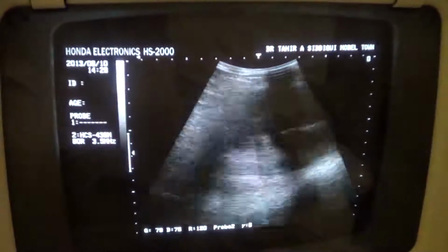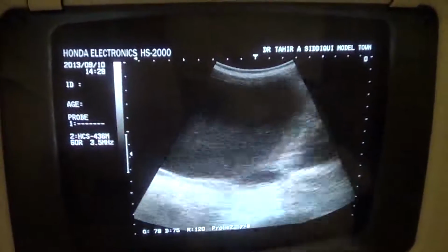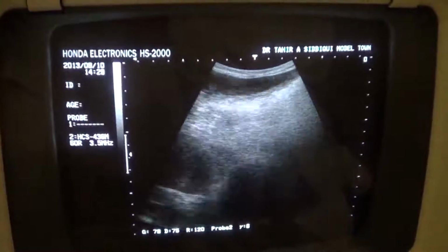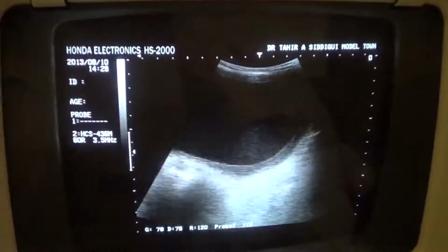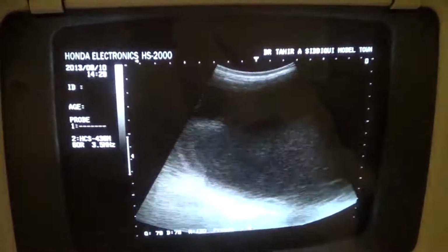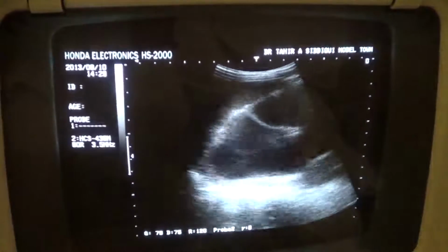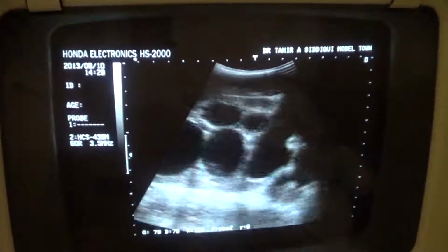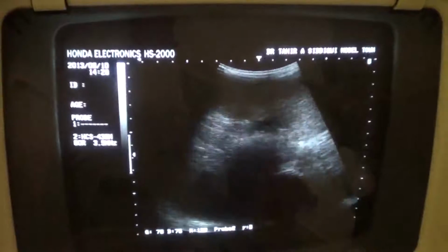So dilated, convoluted ureters with lax anterior abdominal wall, and this over-distended urinary bladder filled with low-level echoes, along with bilateral massive hydronephrosis compromising the thickness of the parenchyma with no calcifications.